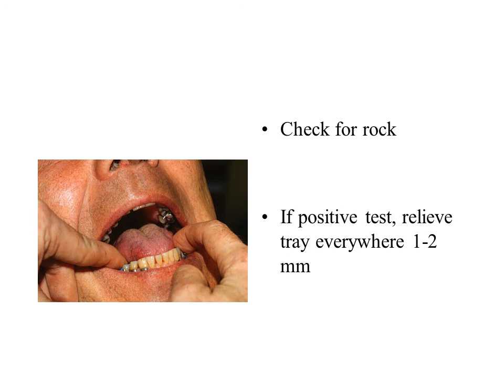After placement of the trial base, test the partial denture for rocking. If there is no rocking, proceed with jaw relation record. If the partial denture rocks, relieve the tissue side of the trial base, border mold, and use rubber base or PVS to make a functional impression with the trial base serving as a tray.